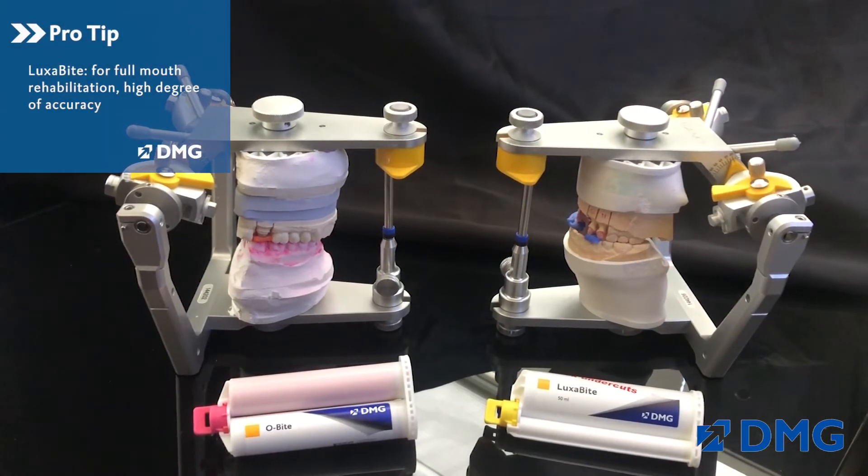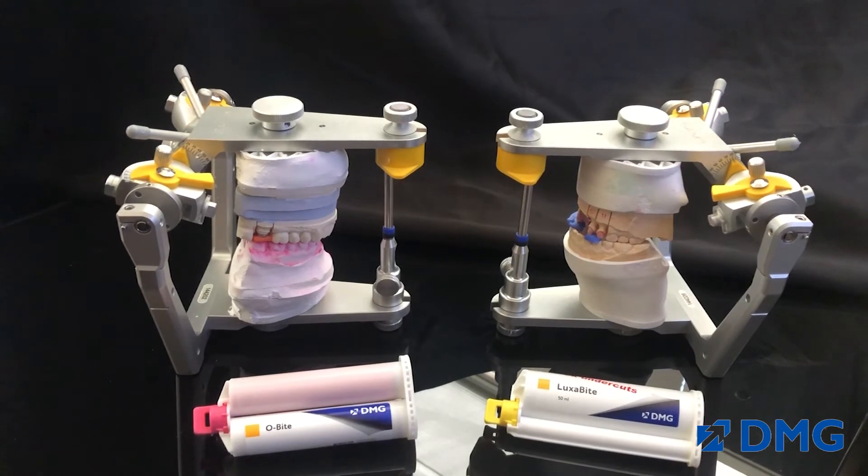This is a bisacryl material, so there's no compression on mounting like you can get with a polyvinyl material. It's very rigid with no sponginess to it, so it has a very high degree of accuracy. But you've got to be careful because if you get it in undercuts it won't come out.